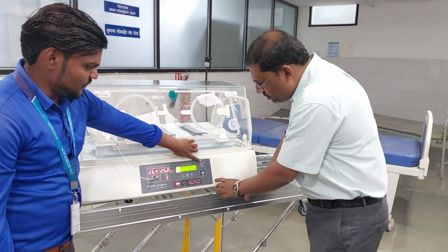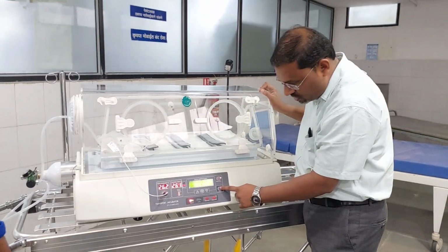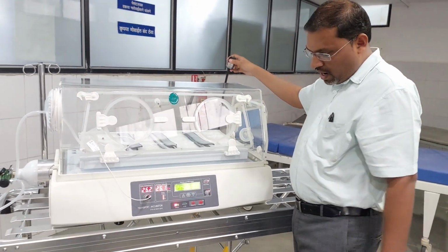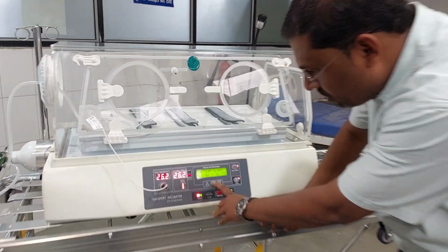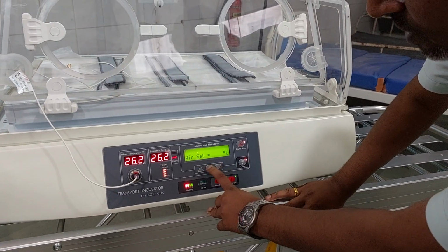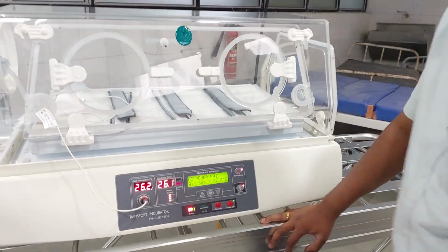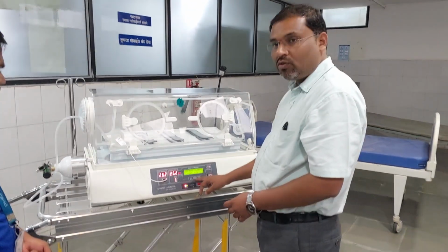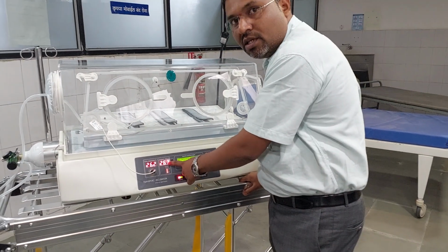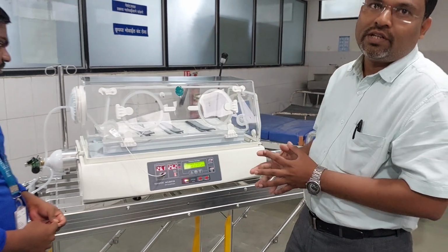See, to mute it, you have to press the alarm mute here. Suppose you want to switch on the lamp, just press it. With the help of this, you can observe the movement of the baby. After that, this is the set temperature. Suppose I want to increase or decrease the temperature, with the help of this knob you can increase or decrease the temperature and set it. What temperature you have set, you can set with this knob. And what is the temperature inside the incubator, it will be shown here. If the temperature is beyond the limit, the machine will give you an alarm. If the temperature is below the limit, the machine will give you an alarm.